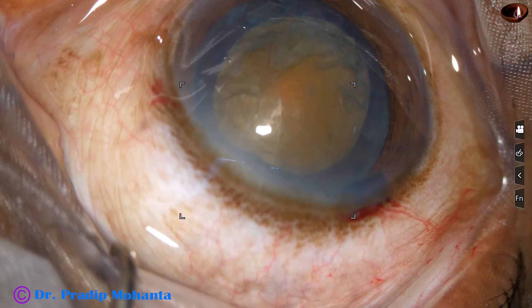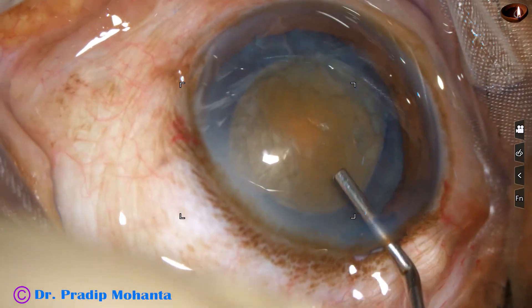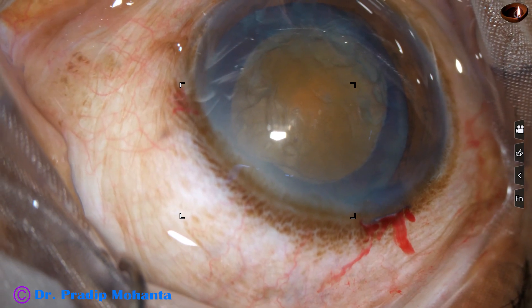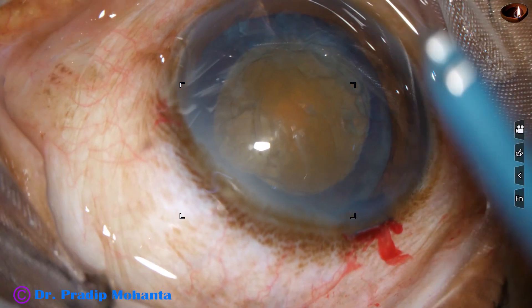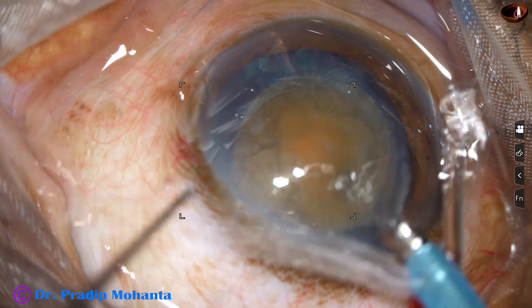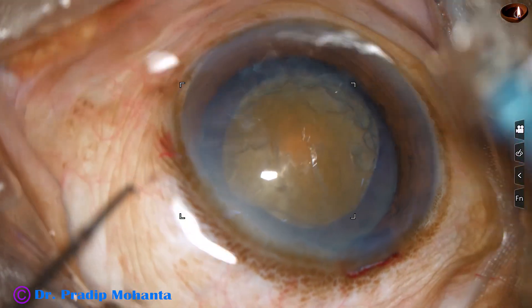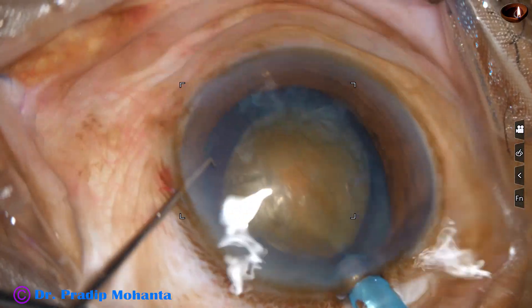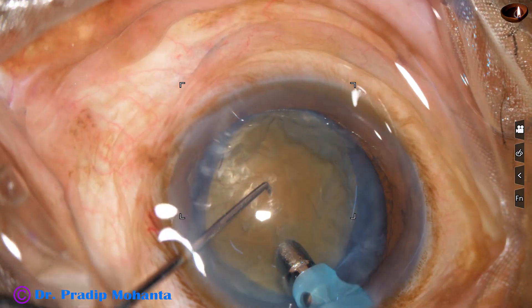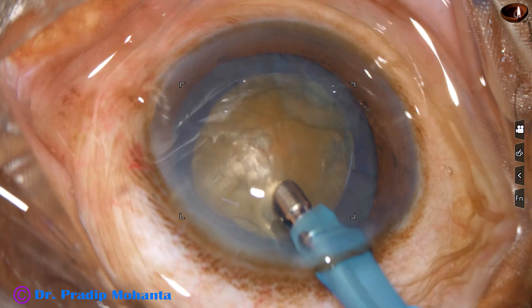Some more viscoelastic is injected into the anterior chamber and now is the time to introduce the tip of the FACO needle. In hard cataracts — in this case it is about grade 4 nuclear sclerosis — the exposed part of the FACO needle is a little more. The FACO needle could not be introduced with its bevel up, so I go bevel down.